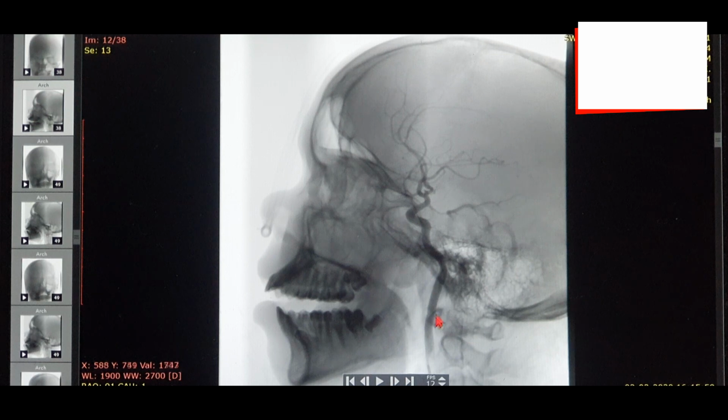Okay, so this is the C1. It enters the skull base, becomes the petrous part. This becomes the foramen lacerum part. This entire thing is a siphon, which is the sphenoidal part. That's the cavernous carotid. As soon as you go up, that's the clinoidal, that's the supraclinoidal, and as you can see the ophthalmic artery arising from here very clearly. That's the ophthalmic artery which is arising, and that is the ophthalmic part of the ICA.